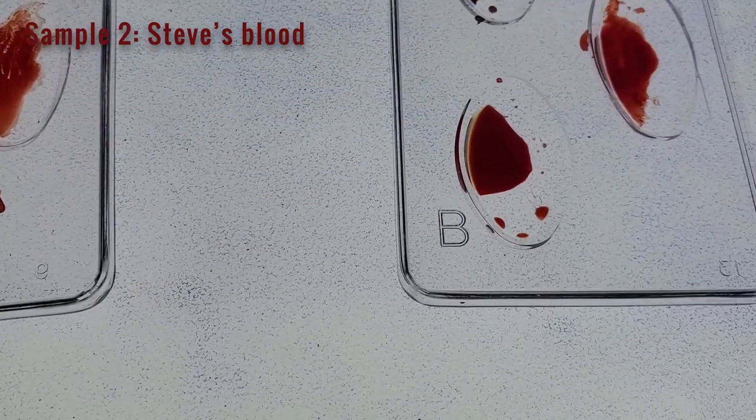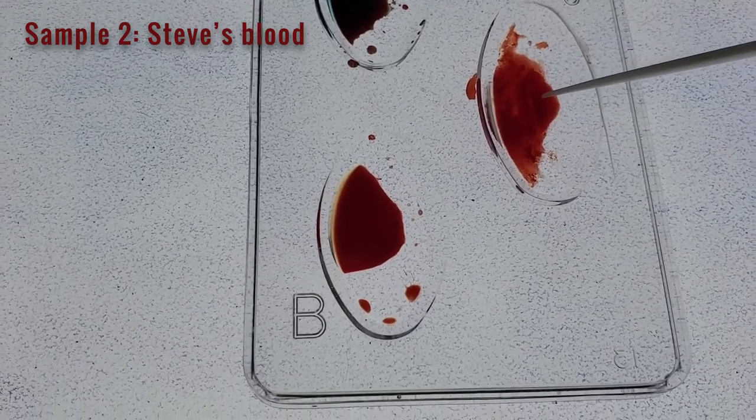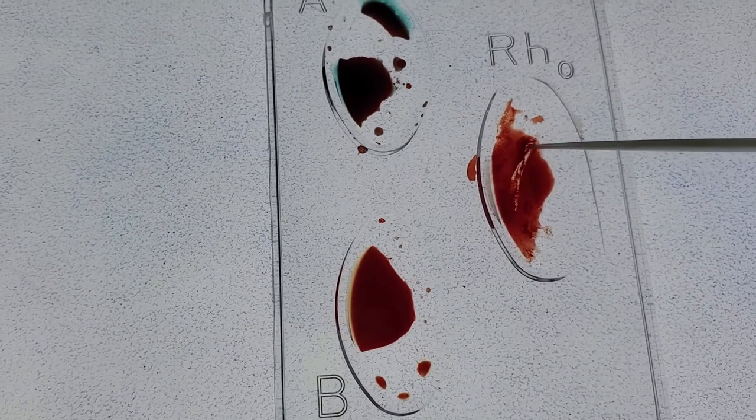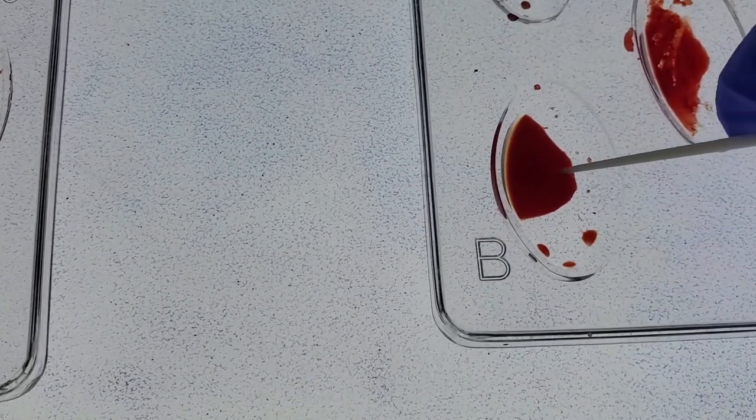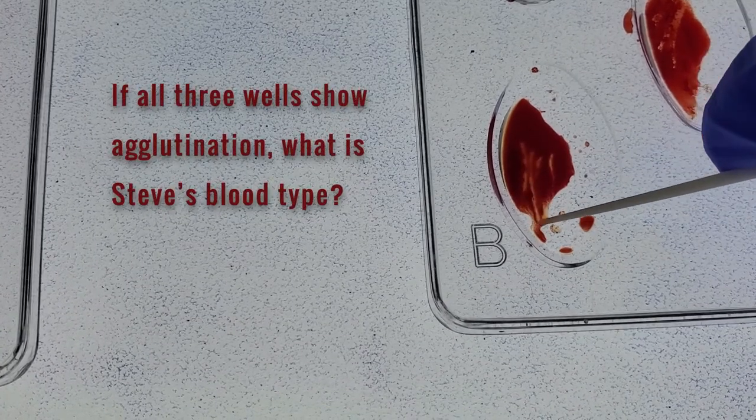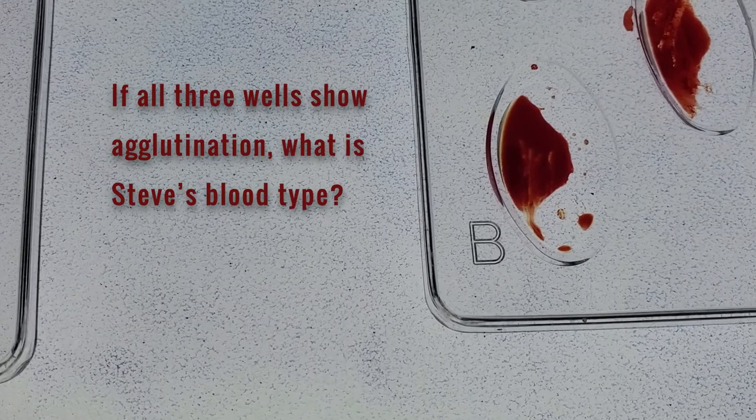In the next blood sample, the Rh shows a strong agglutination reaction again. Looking at A, it's also showing agglutination — maybe even more strongly than the first sample, with blood clearly separated from the fluid in the upper margin. For the B well, on first glance it doesn't look like agglutination, but when picked at with a toothpick and drawn out, the blood does clump back together in a way it didn't in the first sample.